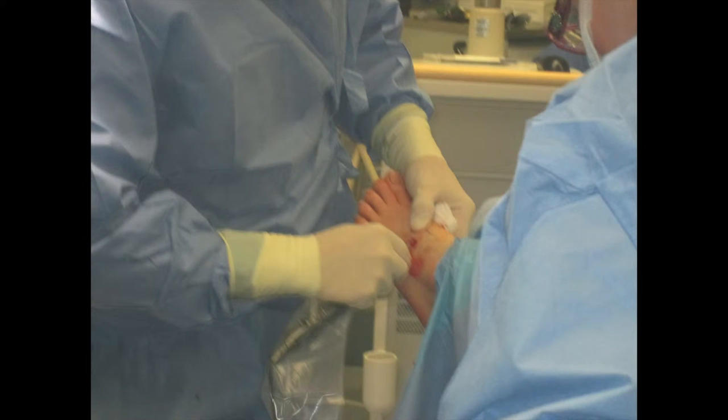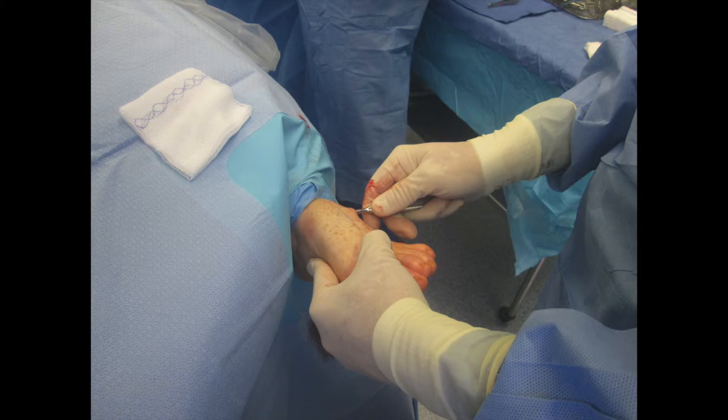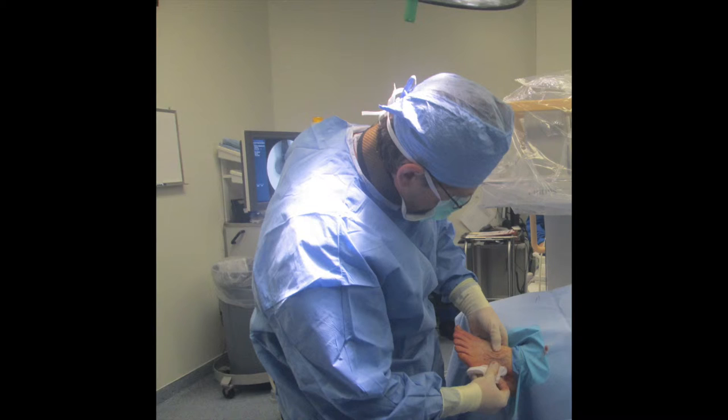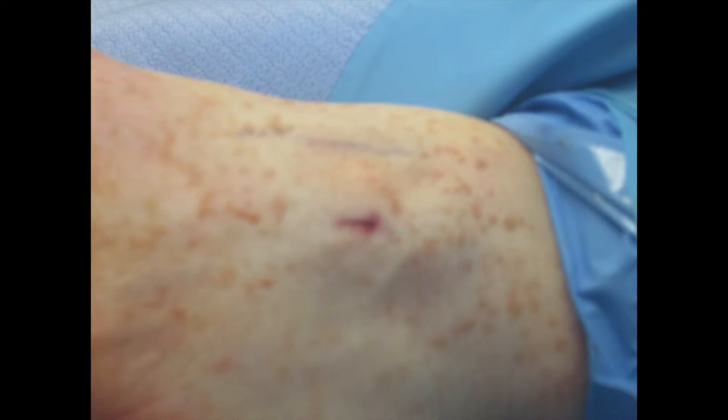Once we began to denude the bony spurring, we were able to express it out as bone paste. Here's our C-arm view post-operatively, right there on the OR table — you can see the amount of exostosis we were able to remove. Once we expressed the bone paste out, we took a small rasp to make sure none of the bony paste remained in the soft tissue. This is how she looked immediately post-op — the exostosis is now gone on the C-arm view. Here's a close-up view of where we placed the incision.